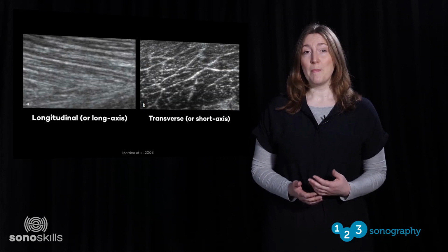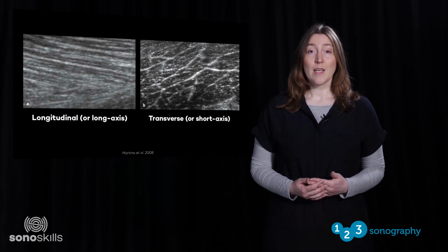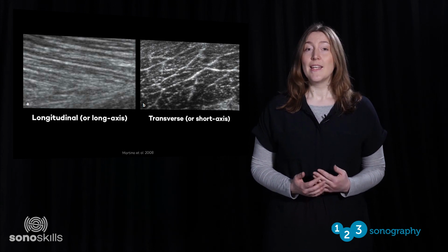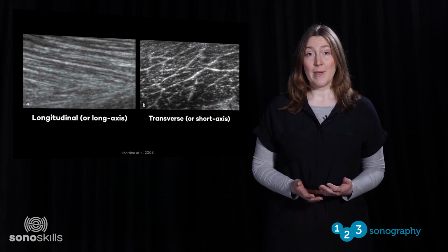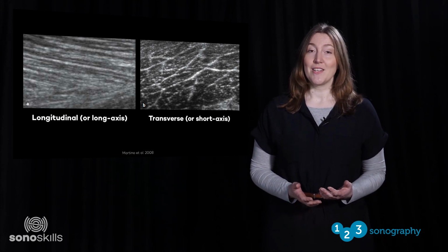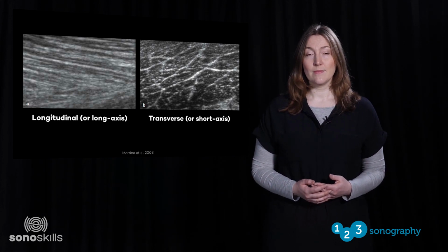With ultrasound, a muscle can be assessed longitudinal or long axis, and it can be assessed transverse or short axis. Now you will have to start thinking three-dimensionally and in planes. I know this can be very challenging, so let me use the following example to explain the matter.